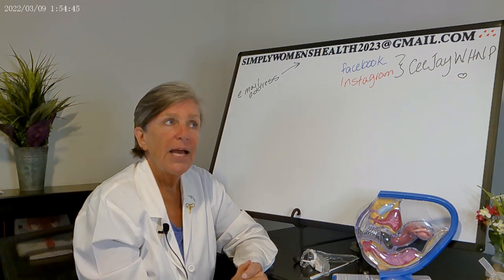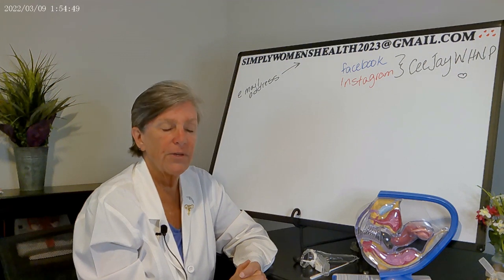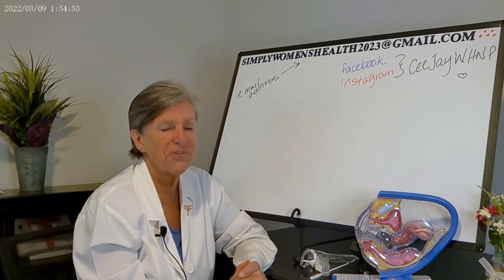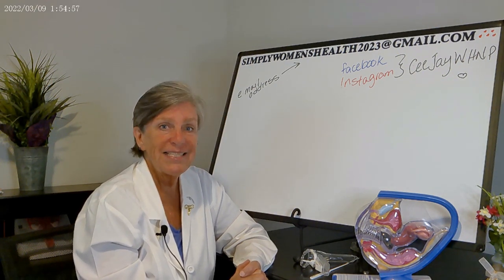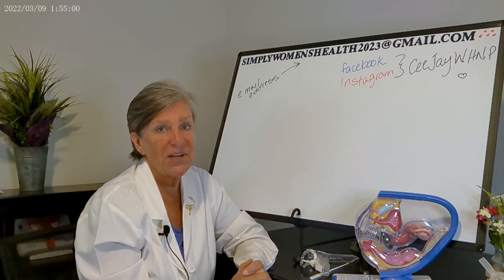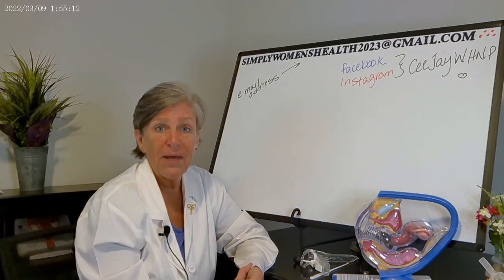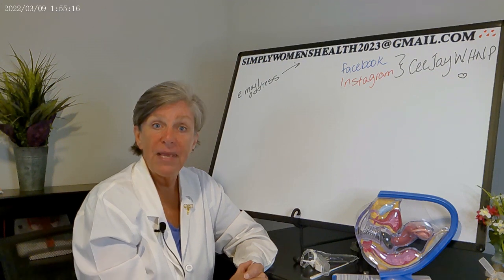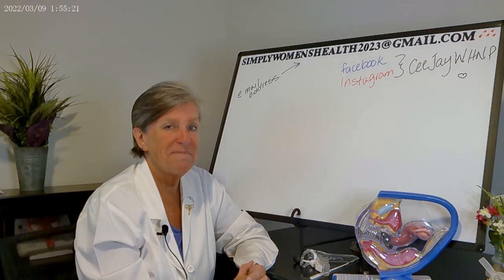I usually encourage my patients once a month, somebody put their fingers up in there and feel for those strings. I don't want you to measure them. I don't want you to tug on them. Just make sure that you can feel them. If you can't feel them, again, that is not an emergency, but you do want to contact your provider and have them put a speculum in and make sure that they can see those strings. Some providers will have you come back for a 6-week string check. That is totally provider dependent, and whatever they recommend you do is what I recommend you do.